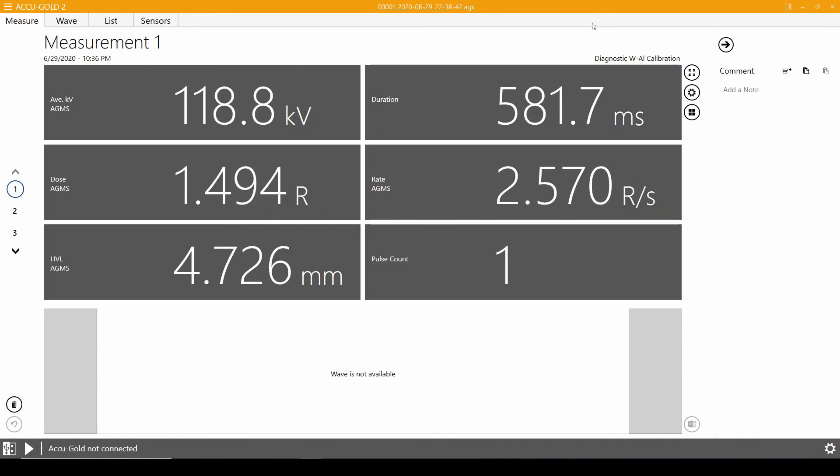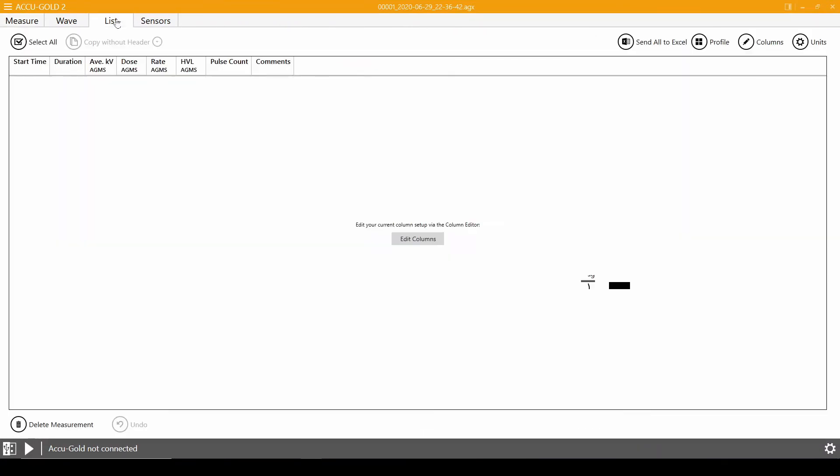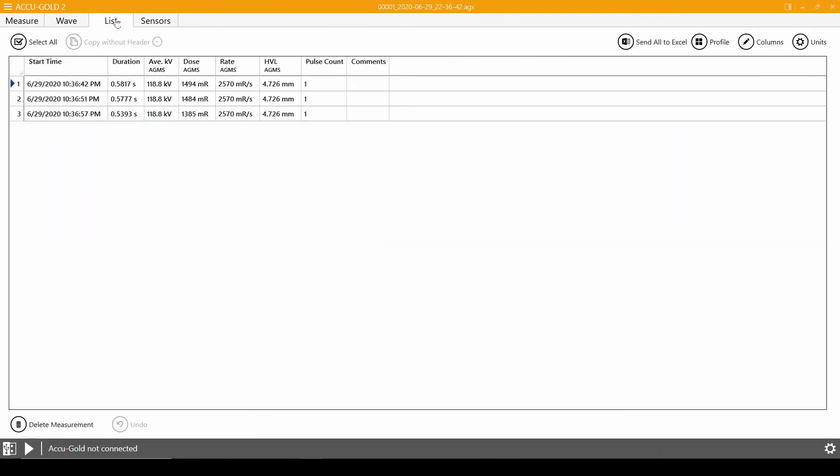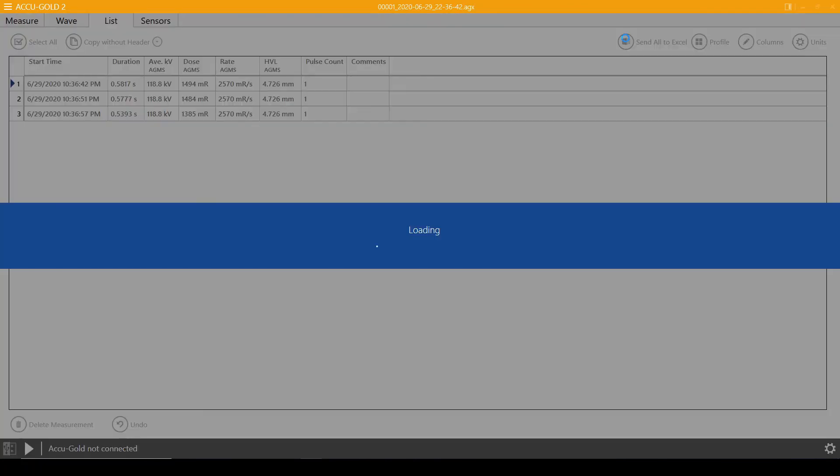Now that the data has been loaded into AccuGold 2, you can export the data to Excel using the list tab. To send all data at once, click the send data to Excel button.